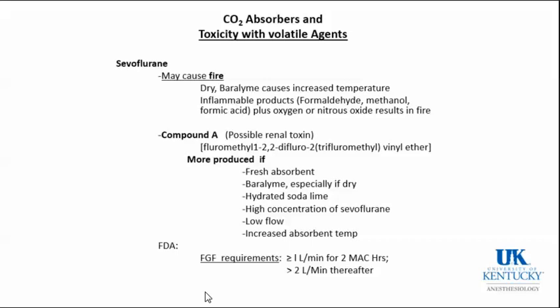The other issue is that the CO2 absorbents will cause production of compound A. Whether compound A is a renal toxin or not in humans continues to be debated. It was particularly bad with Baralime, and again, that's why it was gotten rid of.